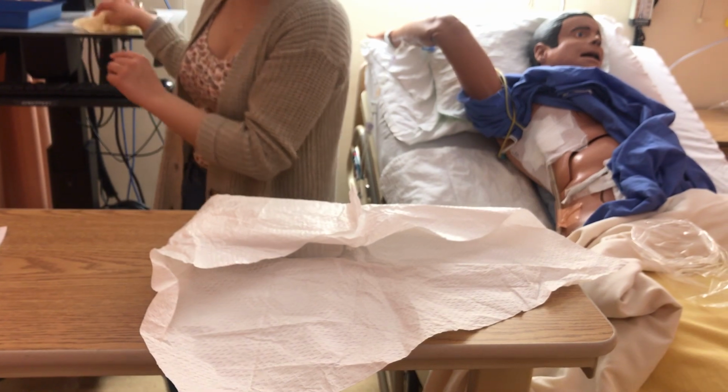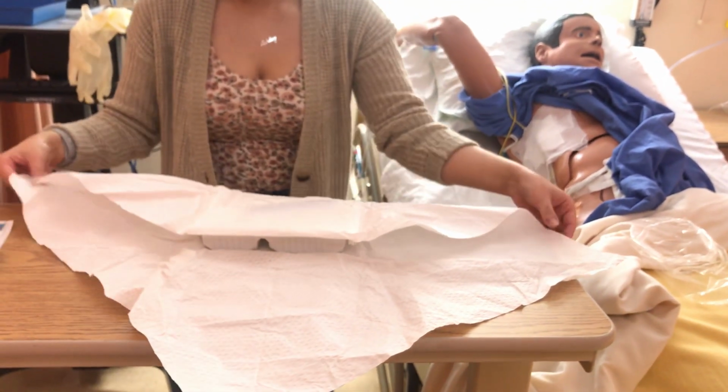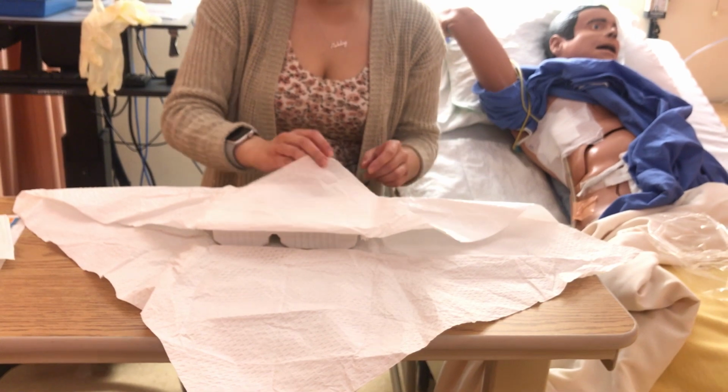So I'll take this off, and make sure I know where my forceps are.